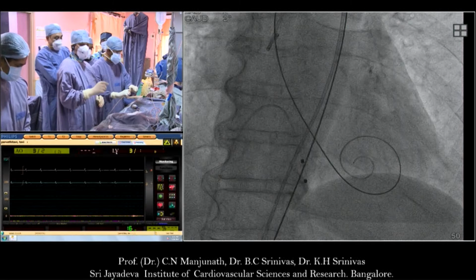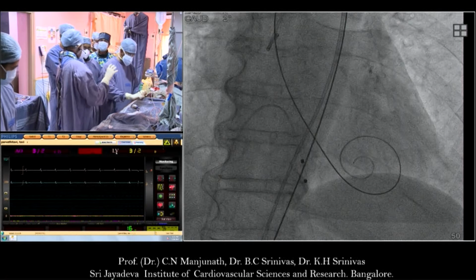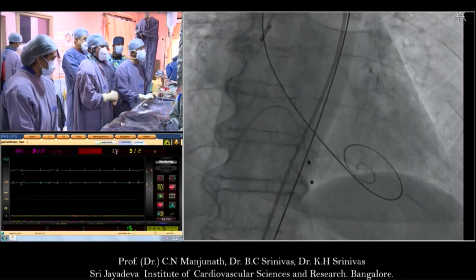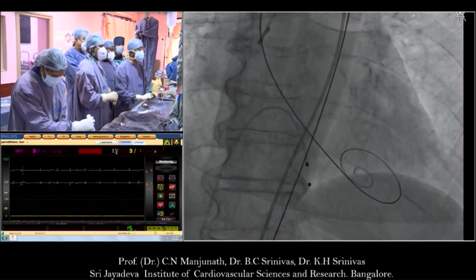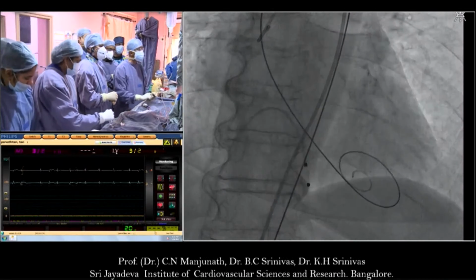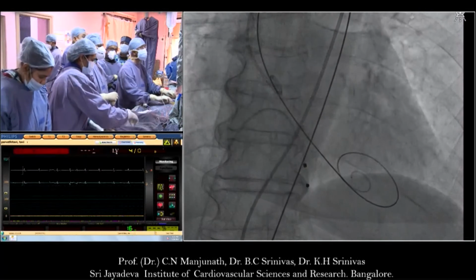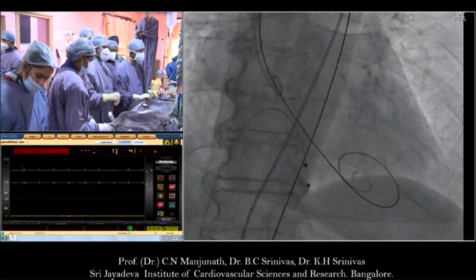Srinivas, can you not go directly? Do you require a balloon dilatation in this case? We thought we'll do a balloon occlusion test. Just because of low coronary height, they wanted to do it. And he agreed that you don't have to pre-dilate earlier.